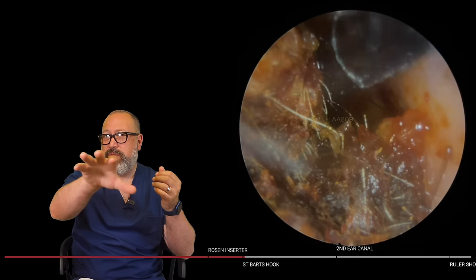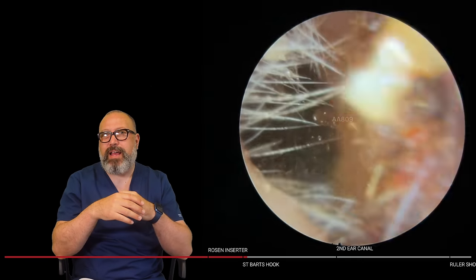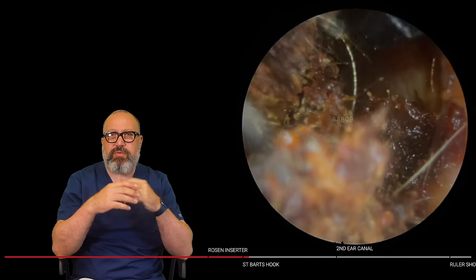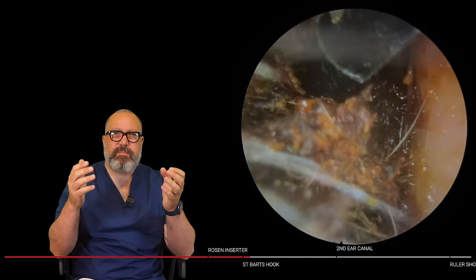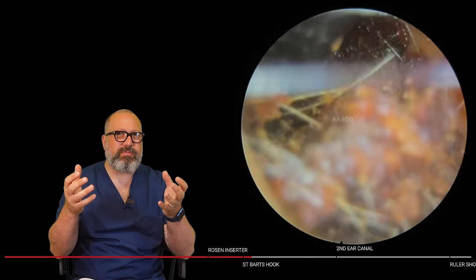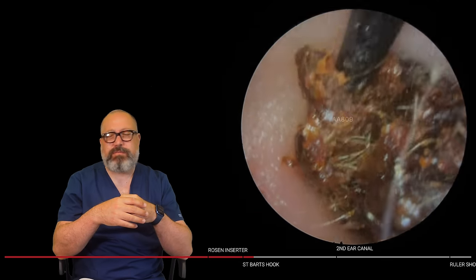St. Bart's hook, perfect. We create the little gap there, wider end on the St. Bart's hook. Even that is struggling here though, because it's just pulling through this plug. All of these sort of tools need a slightly more solid plug really to work effectively. But whoa, there we go. I spoke too soon.